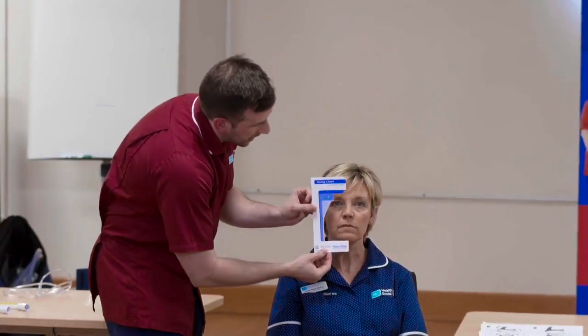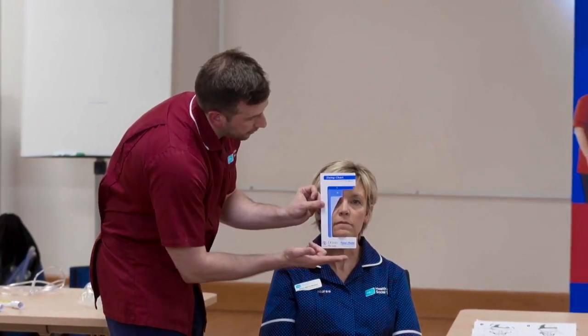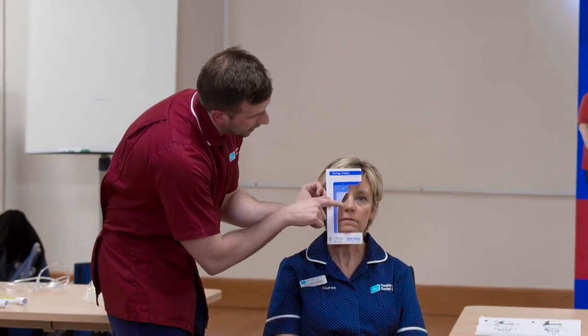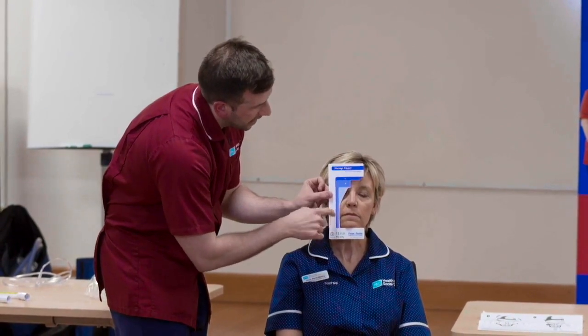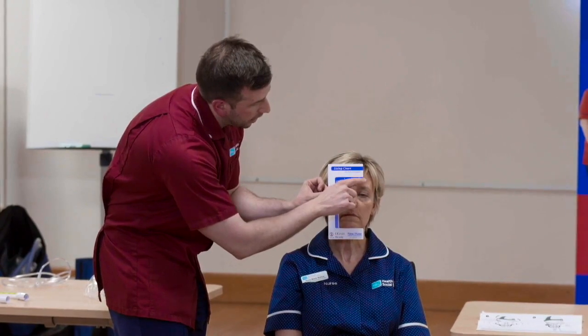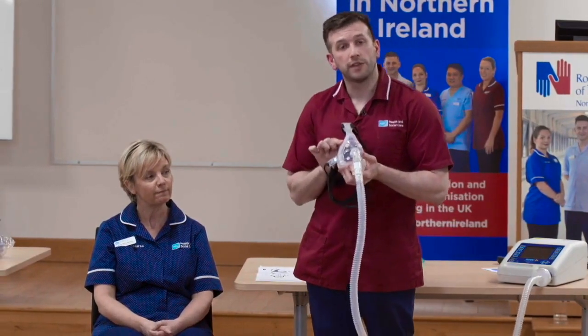As you apply your sizing chart as so, as I say, you're looking to see the interface to be here at the chin to the bridge of the nose. As you can clearly see, Anne-Marie would fit the small size of mask. If it was medium, her nasal bridge would be here, and large would be here. We've selected the small size interface for Anne-Marie.